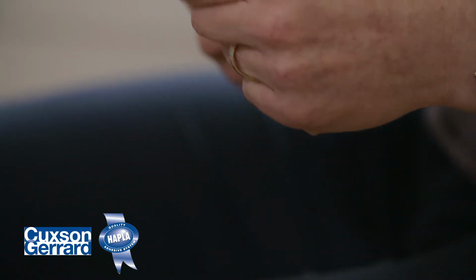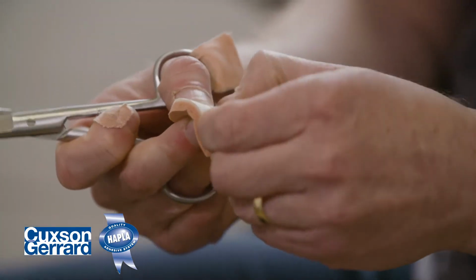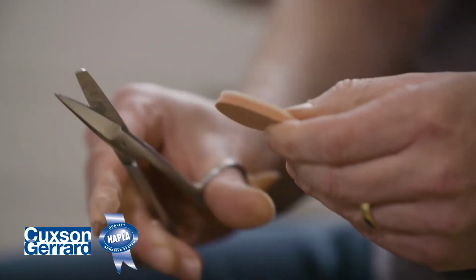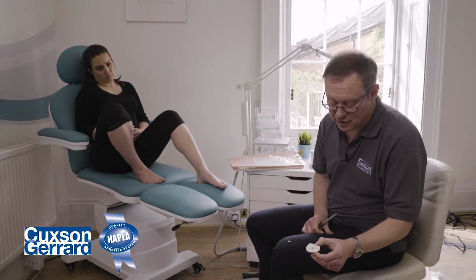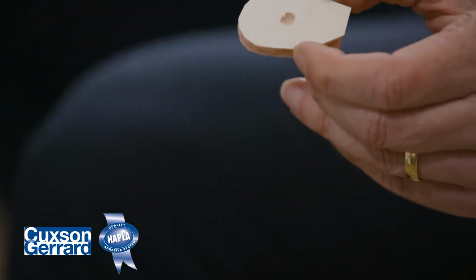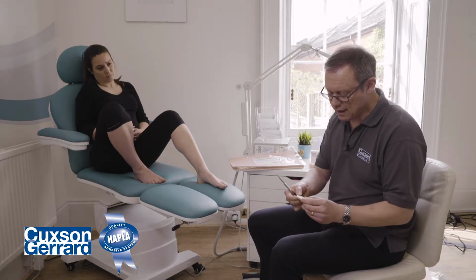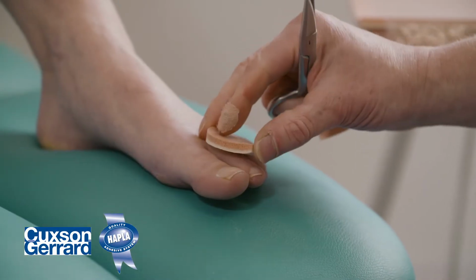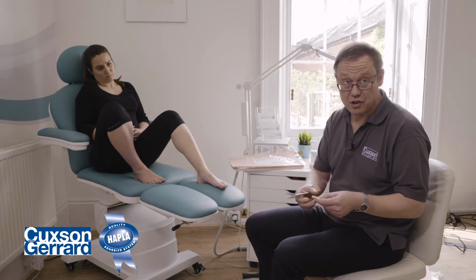Obviously, out comes the paper and some of the felt, and we can tease out the felt as well, leaving a base, although it will become more apparent as I make the hole larger, a nice pink base, so we know we're just touching the surface of the foam. But as I say, when I cut the hole larger, we'll be able to see that more clearly. At this point then, lay it back on the toe to see if we're in the right area. So is the aperture in the right area of the pad? Yep, that's correct. Good. So now, make the hole larger, make the aperture larger.